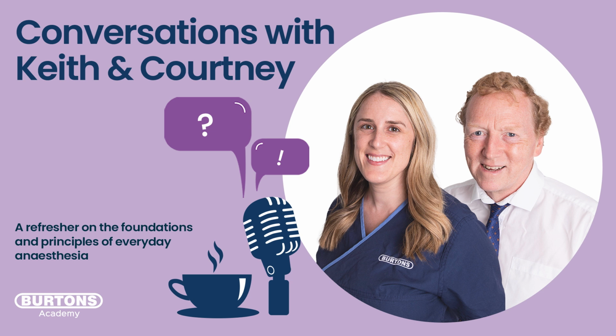So I think we talked about it, maybe in the first episode of this oxygen series. We talked about, if you had a hypoxia due to hypoventilation, then the simplest thing to do is to increase the delivered oxygen fraction up to about 30-35%. So the first thing, if we suspect a hypoxia, would be to get it onto oxygen. Now, that's probably going to be the case anyway. We'd have anesthetized, intubated, and then put it onto 100% oxygen, or close to 100% oxygen.